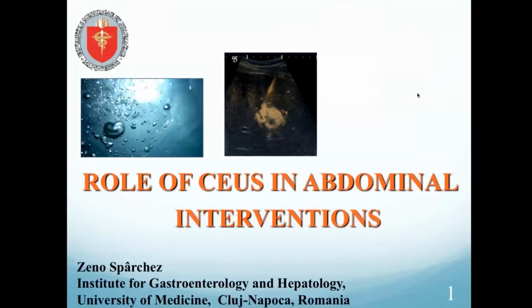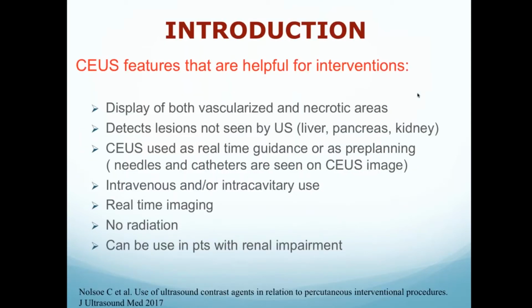First of all, I want to thank EFSUMB for this kind invitation to present our results in this field of using contrast-enhanced ultrasound in abdominal intervention. You have seen from the presentation from Dr. Meloni, it's very important in ablation. I will focus mainly on biopsy in abdominal lesions, and I will focus also on the drainage procedure.